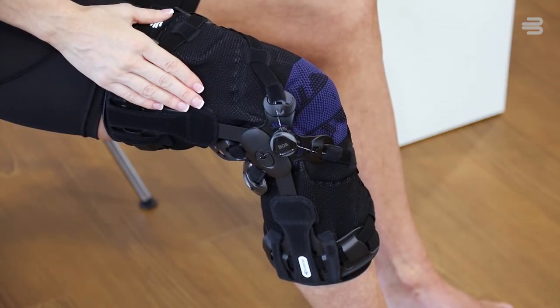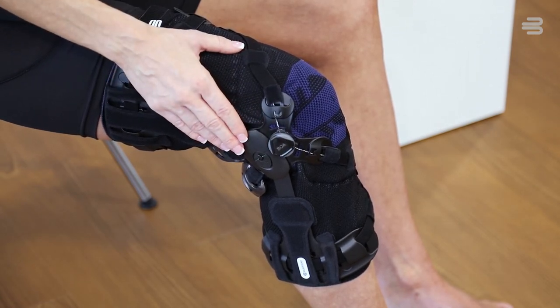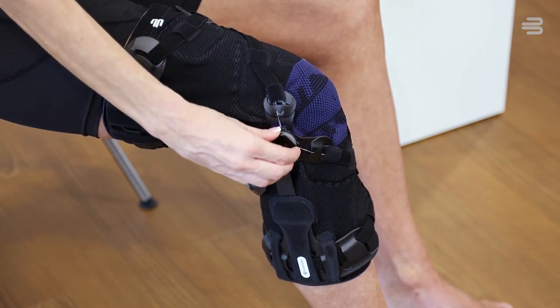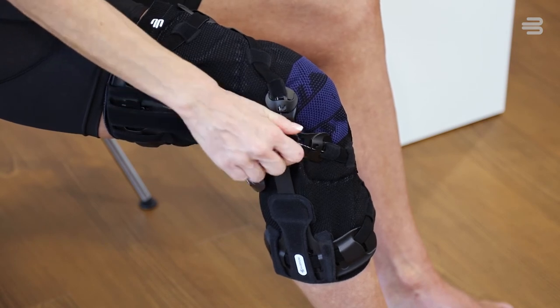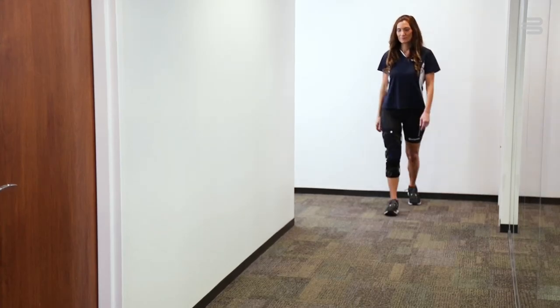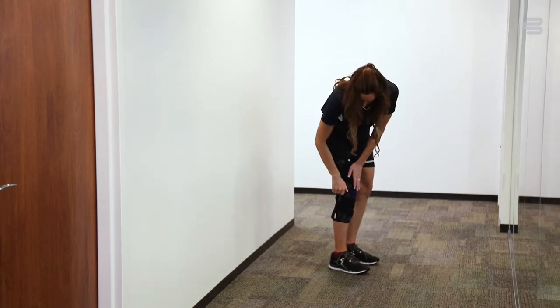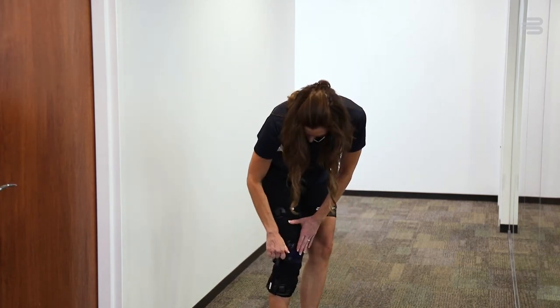To adjust the BOA Fit system, simply press on the dial until you hear a click. This ensures the system is engaged. Turn the knob clockwise until you start feeling relief. Then stand up and walk a few steps. If you feel additional relief is needed, continue tightening by turning the dial in quarter turn increments until you feel no additional relief is needed.